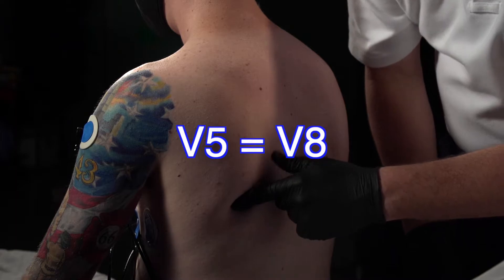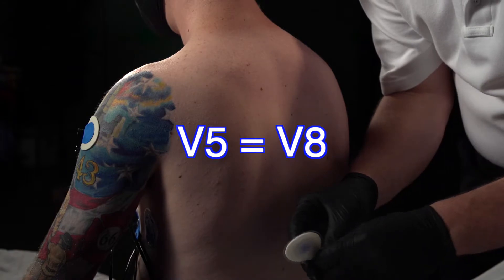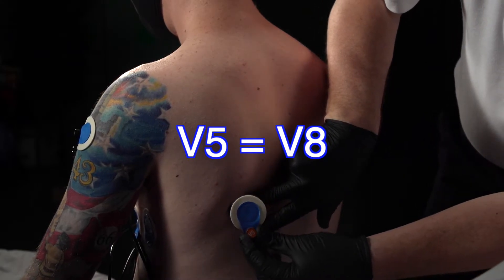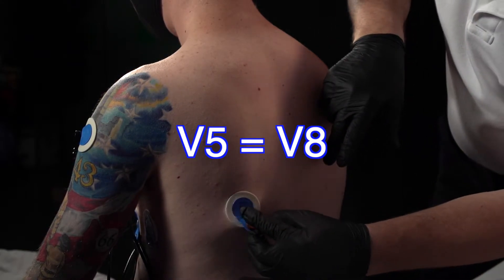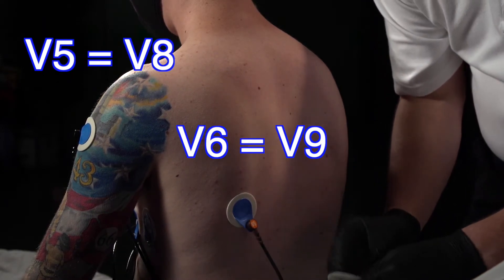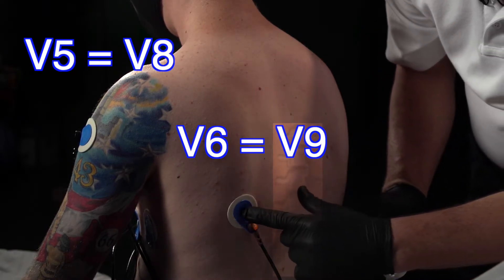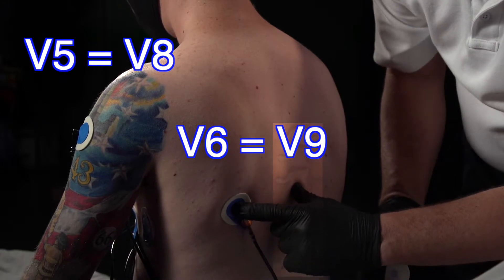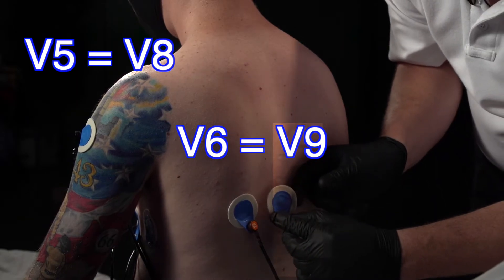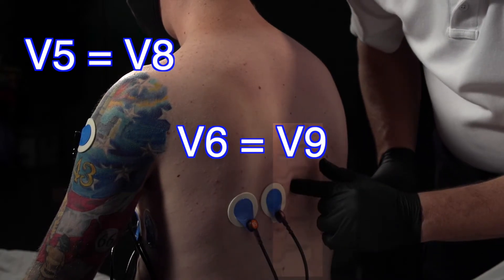Just beneath where the scapula begins to angle laterally is where we place V5, which is going to become V8. Then we're going to place V6, which is now going to become V9. To place V6, locate V5 and also locate the spine — these are our primary landmarks. We're going to split the difference and put V6 paraspinal between the mid-scapular space, but not on the spine.